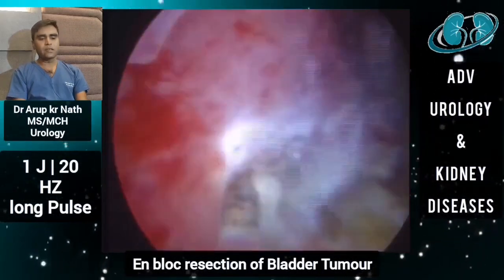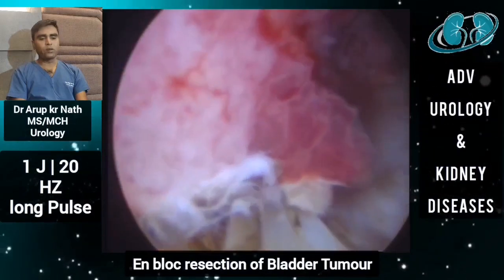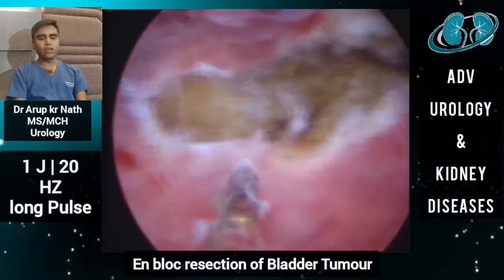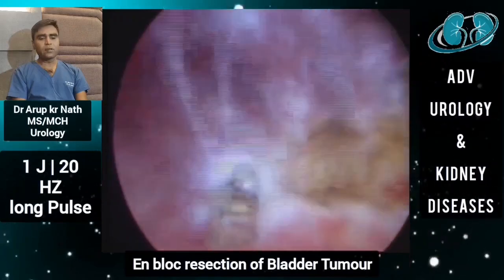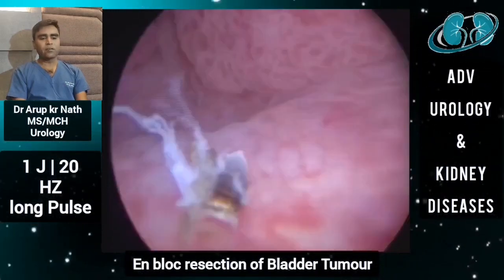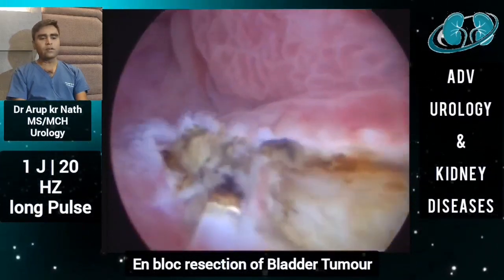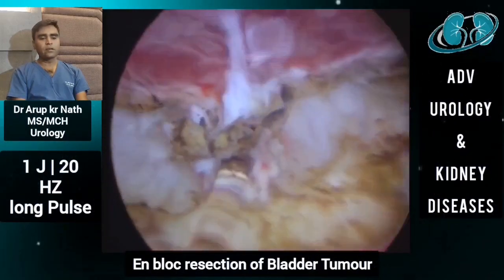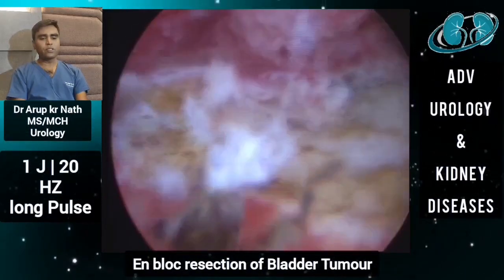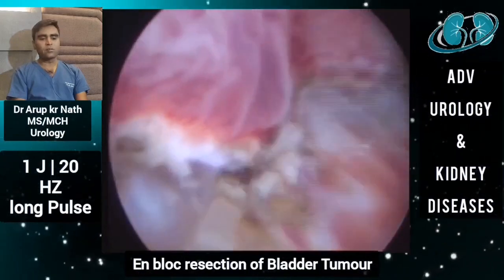We then start elevating the tumor by incising at the margin and going down to the detrusor muscle. When we incise, we need to go to the level of the detrusor muscle, and once we get the plane, we gradually start elevating the mass mechanically from the detrusor muscle. As you can see, the detrusor muscle is now visible and we are elevating the mass from it. That bluish structure is the detrusor muscle, and you can see how beautifully the tumor can be resected out from the base.